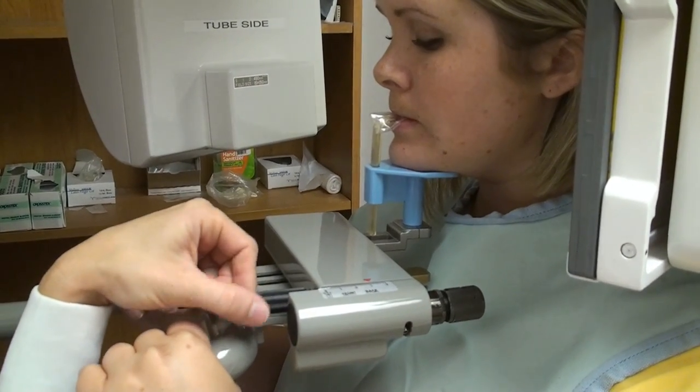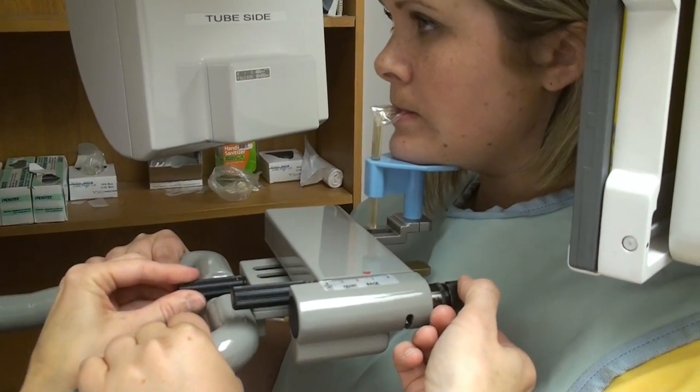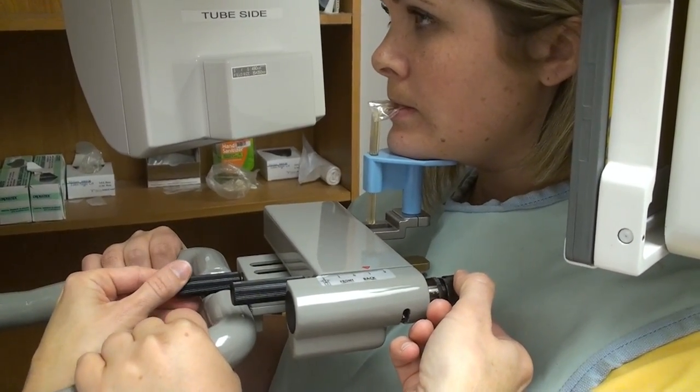The knob right under her chin is how you're going to move it to get it in the right position. This other knob doesn't do anything — it used to be the head holding rods. So find the light with your right and position it with the knob that's under her chin. I found the light — you can see it's on her forehead, so I'm going to bring it down to her mouth. Go ahead and give me a big smile with your teeth open. I'm going to position the light by changing the knob under her chin and put it right on that maxillary canine.